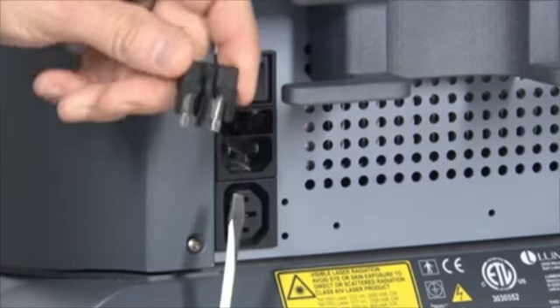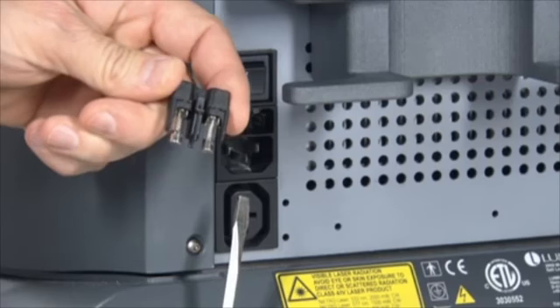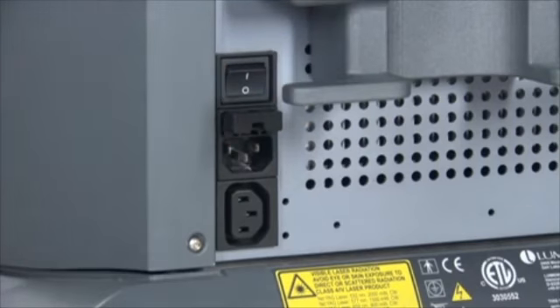Replace the fuses as follows. If the wall voltage is 100 or 120 volts AC, use two fuses rated 250 volt, type T, 8 amps, slow blow, 5 mm by 20 mm. If the wall voltage is 230 volts AC, use one fuse rated 250 volts, type T, 4 amps, slow blow, 5 mm by 20 mm. Insert the fuse holders and press until it locks into place.